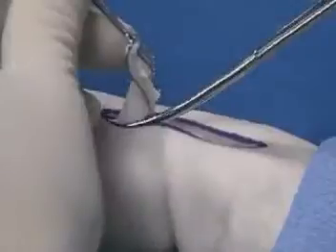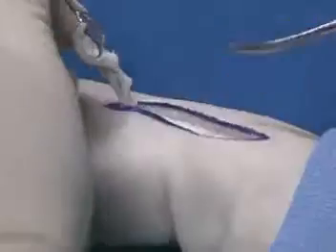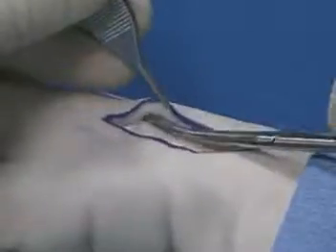The skin to be excised can be held with a forceps or a skin hook. The middle finger can also be used to aid in the retraction of the soft tissue during the dissection. In order to allow the tissues to come together during the closure, undermining is necessary.